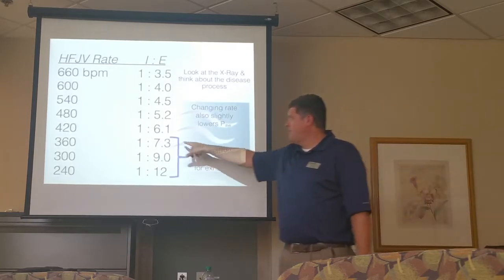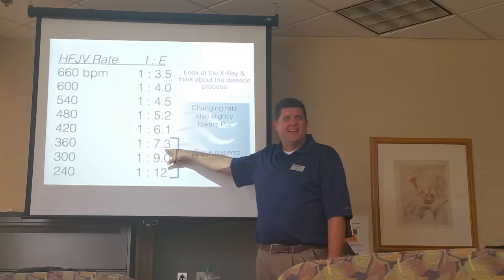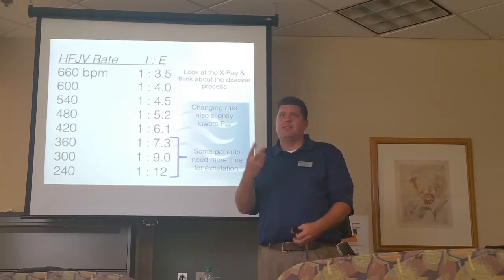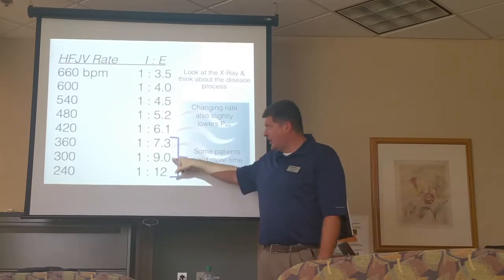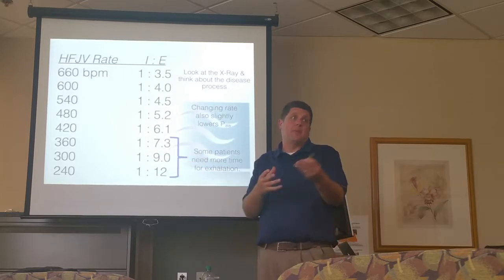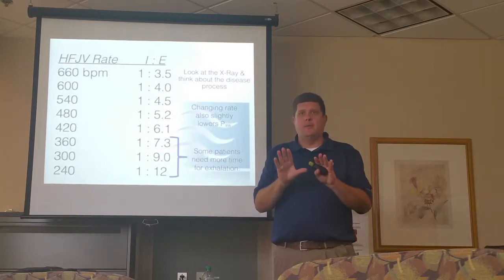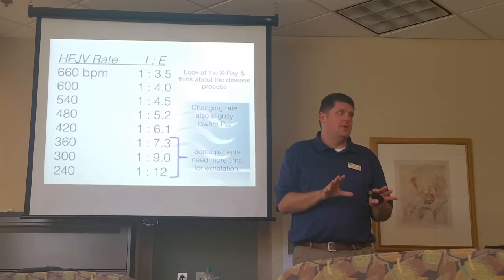Okay, I've been on 420, the X-ray's still overinflated, let's go down to 360. And then if you've been at 360 for 2 days and that X-ray still looks overinflated as much as it did, then go down to 300, okay? That's the whole idea. So that's when I would change the rate, is really based on my X-ray. Let the X-ray tell you what to do with it.